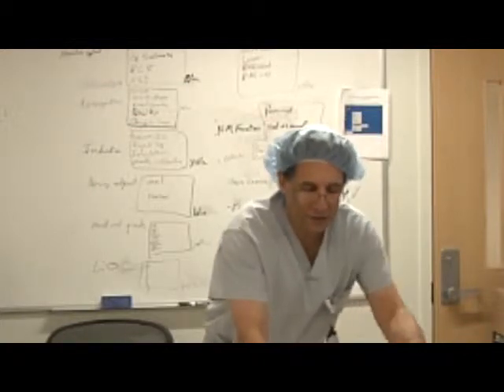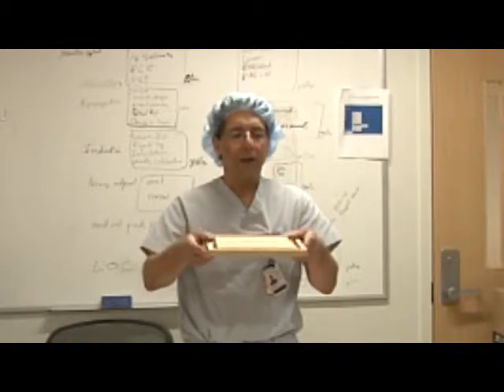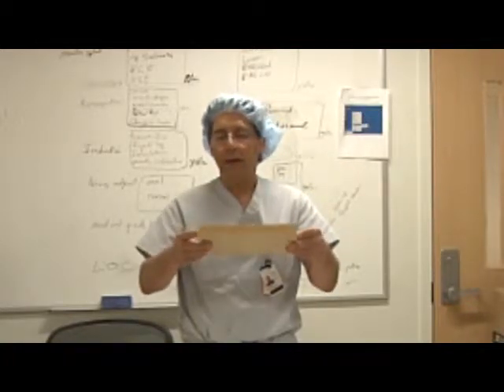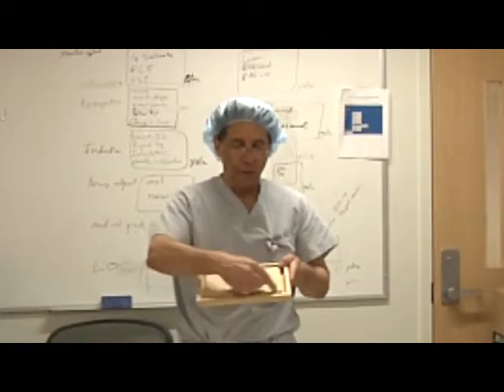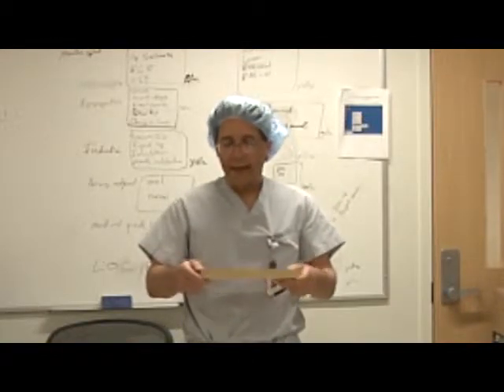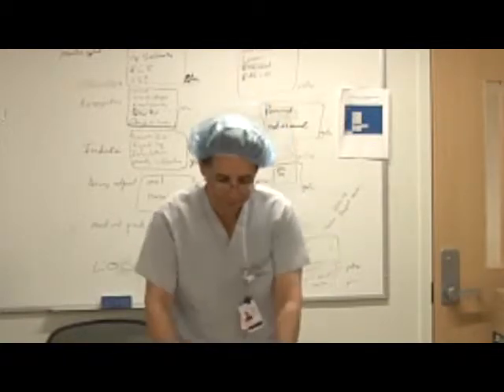Any kind of board is fine. It should probably be about 3/4 of an inch, any type of wood. This is a special board that's used by AOD that has a groove around the edge, and it measures about 8 inches by 6 inches minimum.